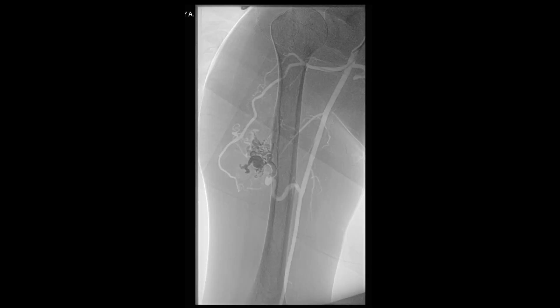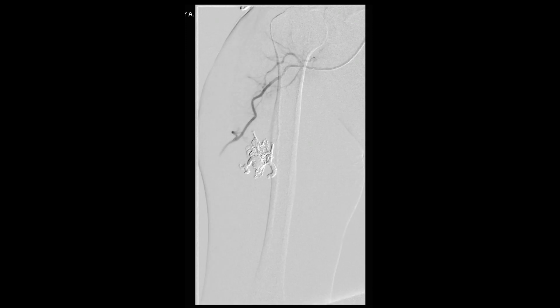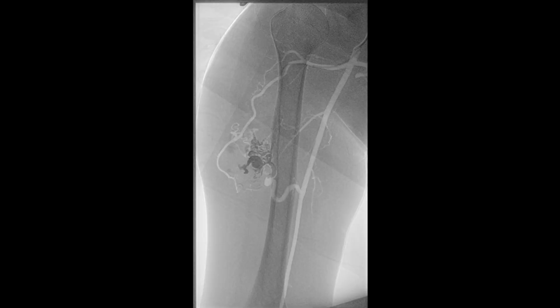We then proceeded to select the lateral circumflex humeral artery coming off the axillary artery and feeding into the arteriovenous malformation. Next, a micro catheter was introduced into this branch of the axillary artery and a selective angiogram was then performed to delineate the anatomy of this branch feeding into the AV malformation. Shown here is the micro catheter positioned in this branch of the axillary artery.